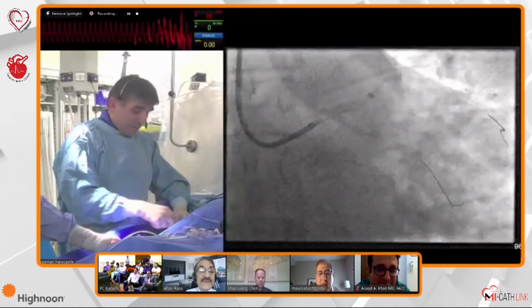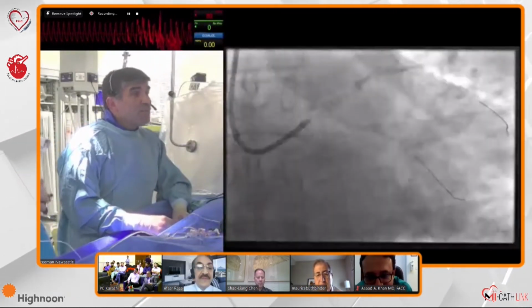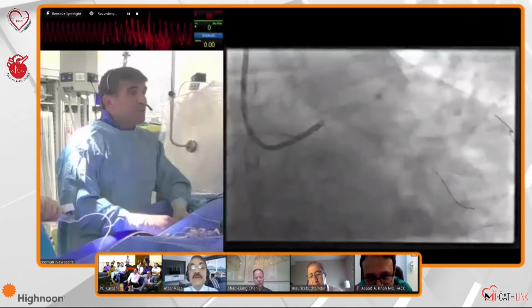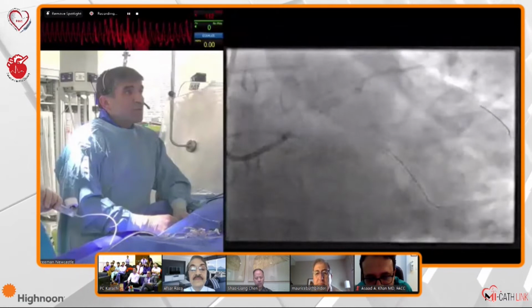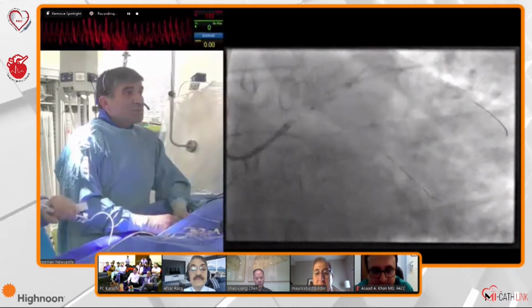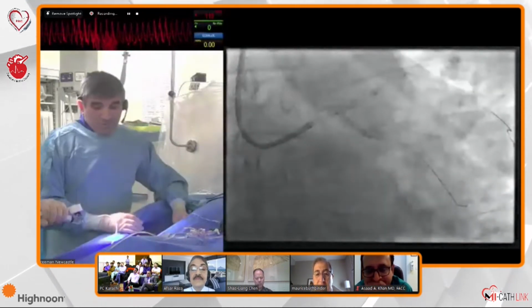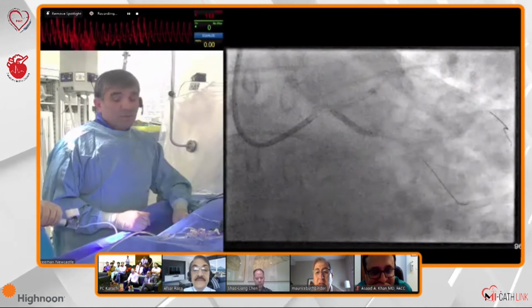This is my view. I know a lot of people do it and believe in it, and this is the beauty. I mean, the bifurcation. This is why we never have a proper bifurcation stent, because the anatomy differs from everybody. Okay, go up there so you don't crush. I don't crush. I just think there are better ways of doing that.